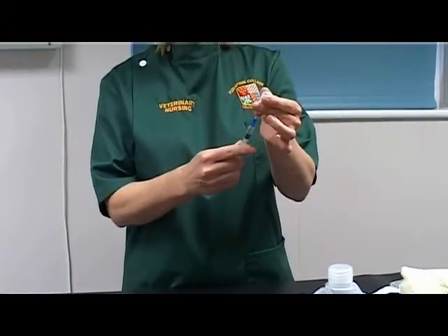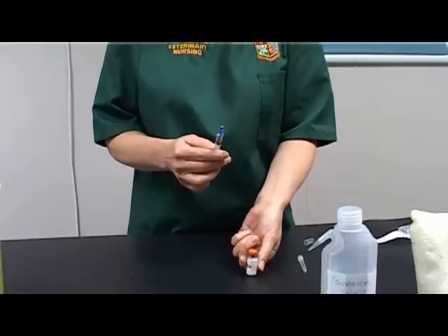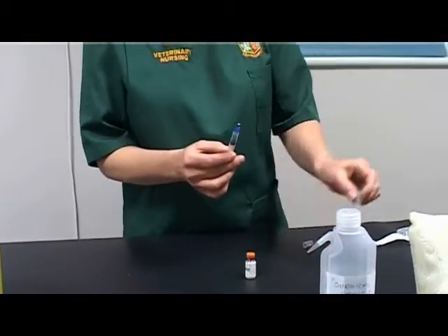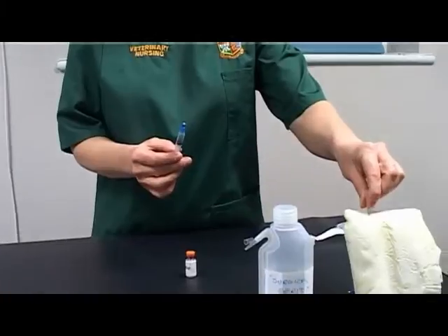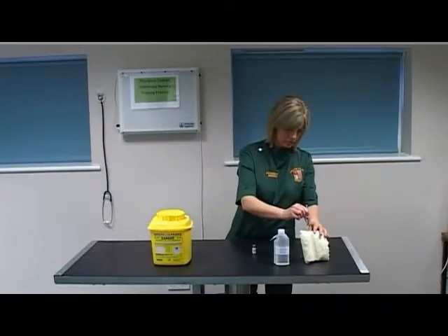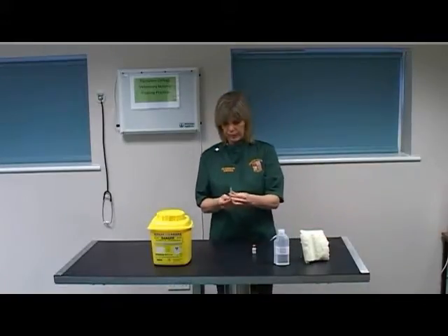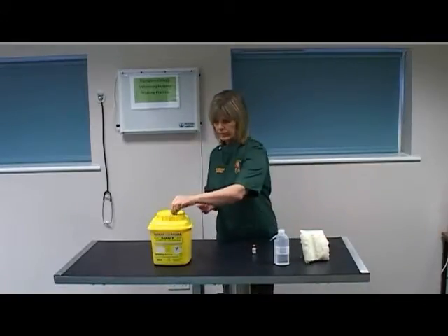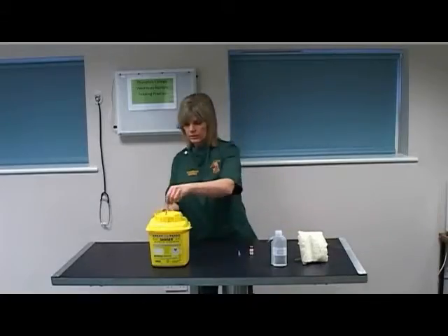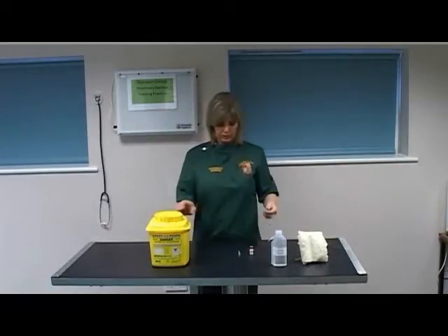Withdraw the needle from the vial. Change the needle and dispose of appropriately. This can be done by either re-sheathing safely using a foam block, or placing the unsheathed needle directly into the sharps container.